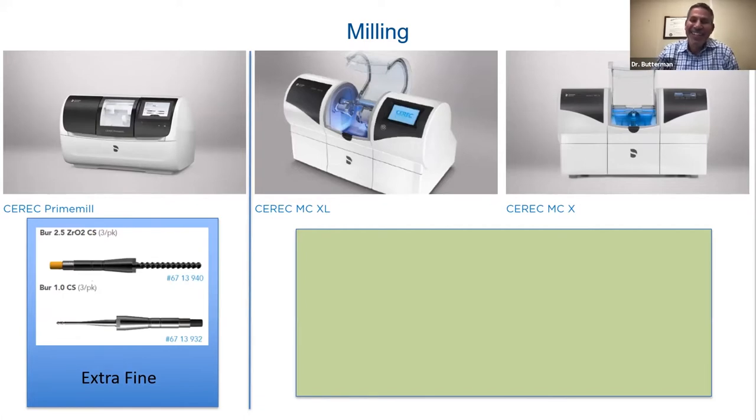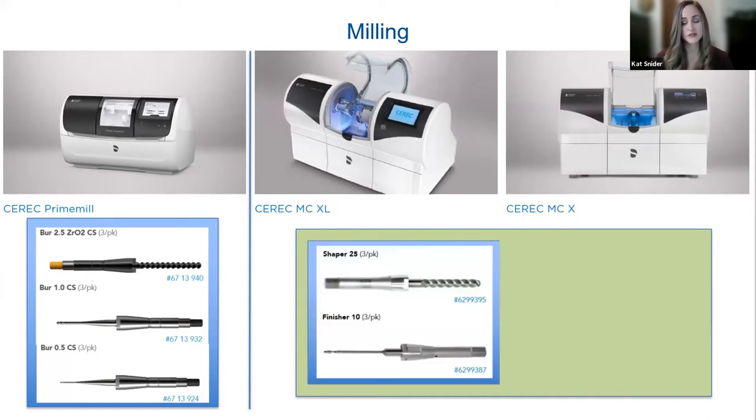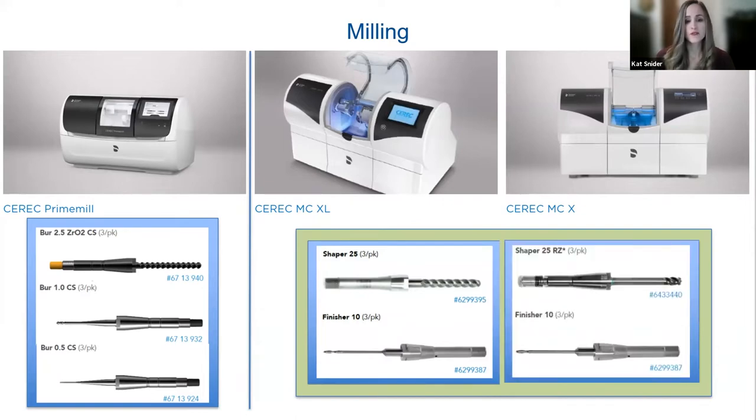If you are milling it, you do want to mill it dry if you can, which means you're going to have a vacuum hooked up to your mill somewhere to give you the ability to mill it dry. If you are milling dry in the MCX or the MCXL, you're going to be using the Shaper 25 and Finisher 10. But if you are working with an older mill unit and maybe you don't have the dry mill capabilities, it is possible to mill this wet as well. We are just going to swap out the 25 for the 25RZ. So pretty much any CEREC mill is able to mill this material.